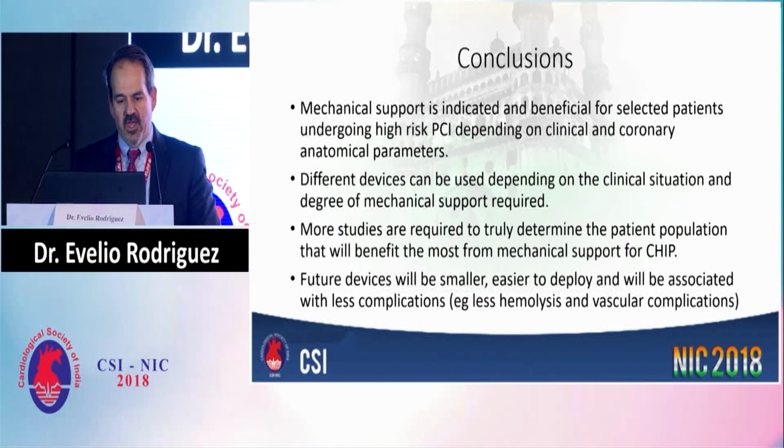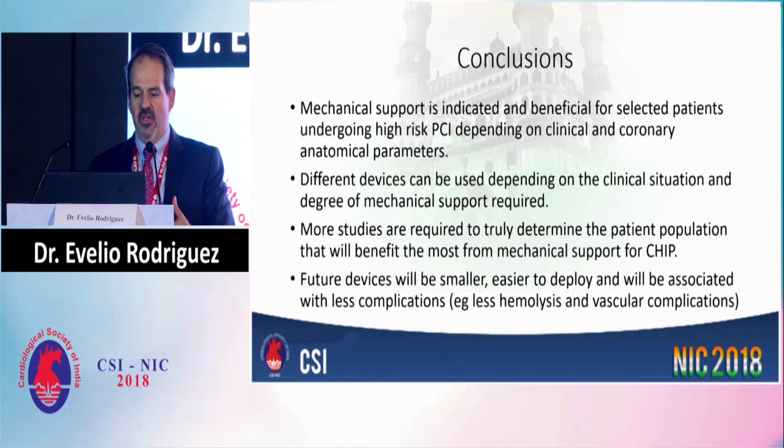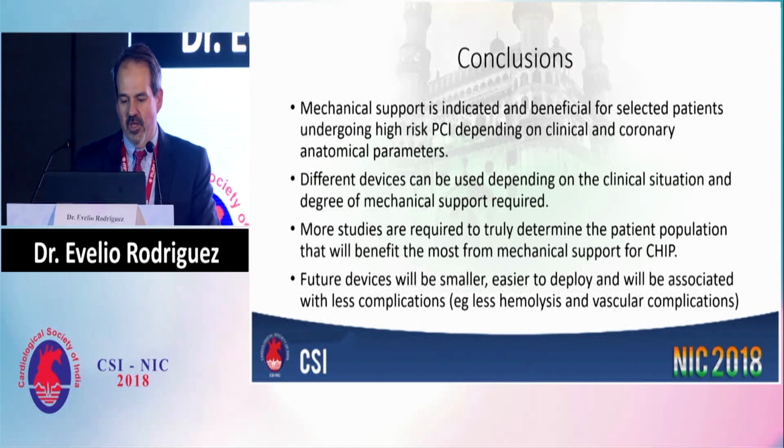So in conclusion, mechanical support is indicated and beneficial for selected patients undergoing high-risk PCI. Different devices can be used depending on the clinical situation. More studies are really needed to know the true value of these devices. And I think in the future, the devices are going to get smaller and easier to deploy, with less hemolysis and fewer vascular complications.